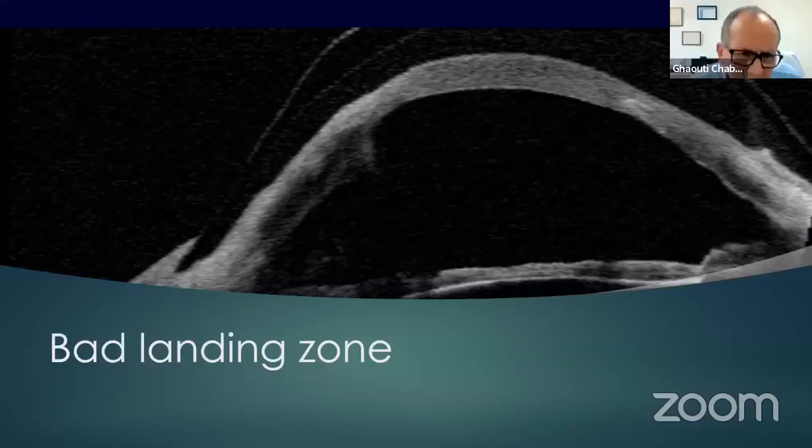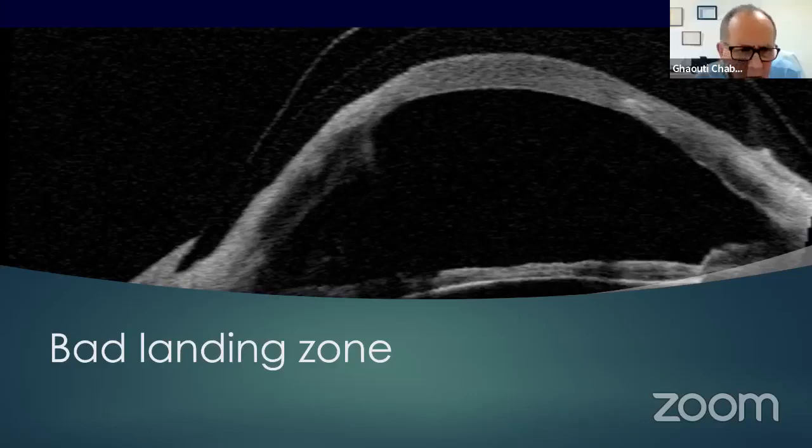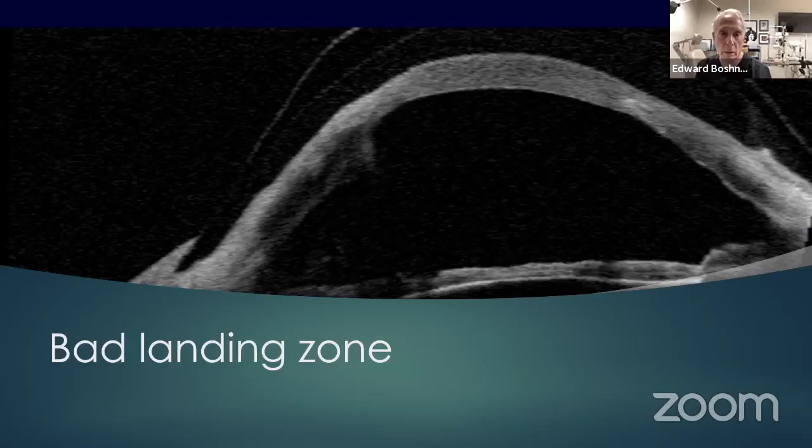Yes, one side, I can see one side. This was not my lens. This is a lens a patient came in with, so I'm innocent on that. It's digging into the sclera, into the conjunctiva. Yeah.